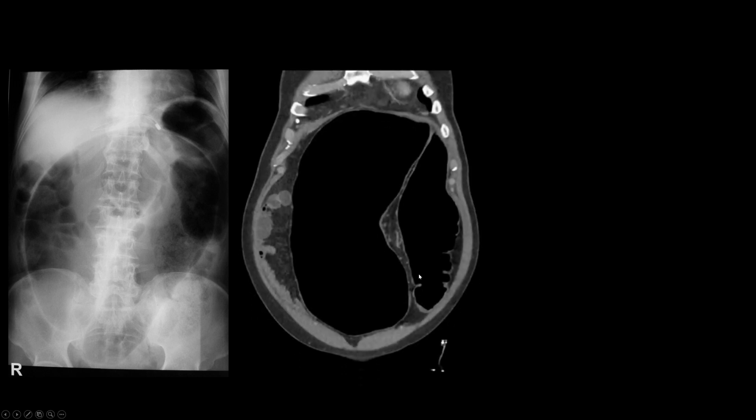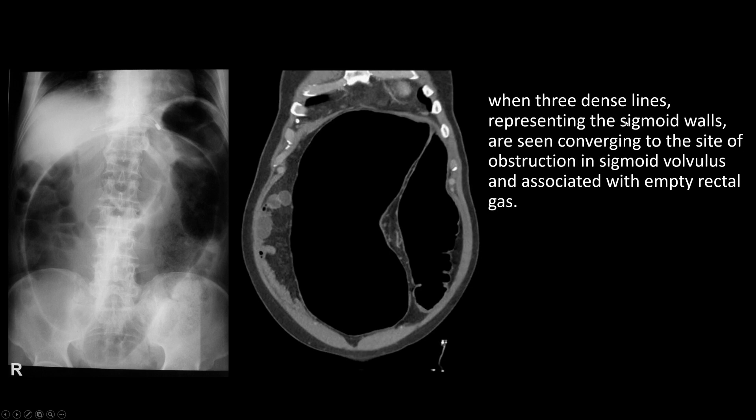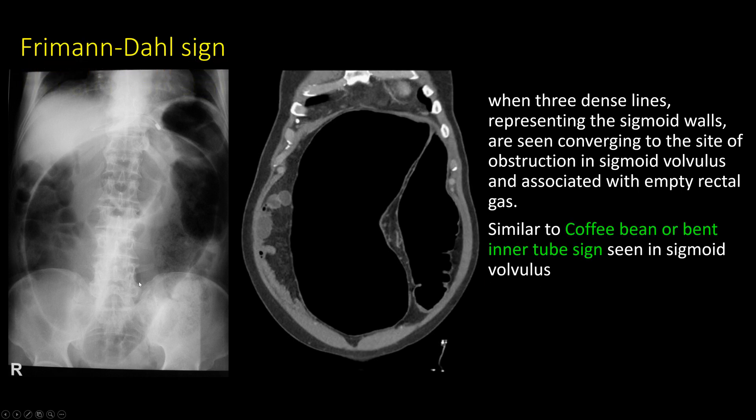Next case: a patient presented with vomiting, abdominal pain, and constipation. There is a large dilated bowel loop in the mid-abdomen extending from the right lower quadrant to the left upper quadrant. Three dense lines are seen converging to the origin of the obstruction. This is classically described as the coffee bean sign or inner bent tube appearance in sigmoid volvulus. When these three dense lines representing the sigmoid wall converge to the site of obstruction, associated with an empty rectum, this is called the Freeman-Dahl sign.